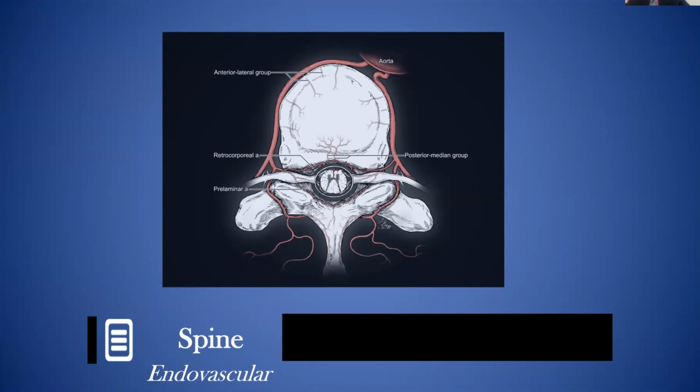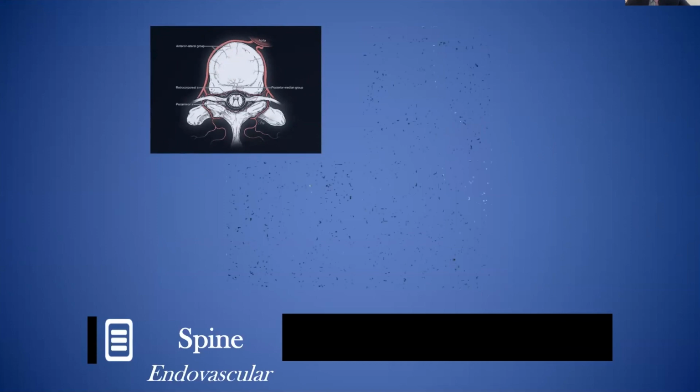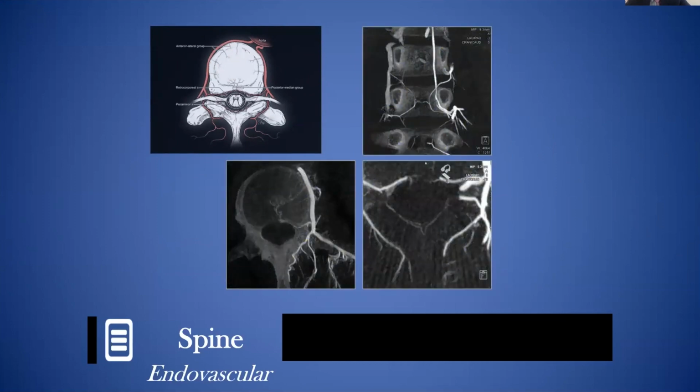We place a catheter in individual vessels and inject and take pictures. And you guys during your neurosurgical training will perform angiography. We train the neurosurgical residents at our practice. It's becoming more and more of an integral part of neurosurgical practice, really, particularly if you plan to do any sort of vascular work.